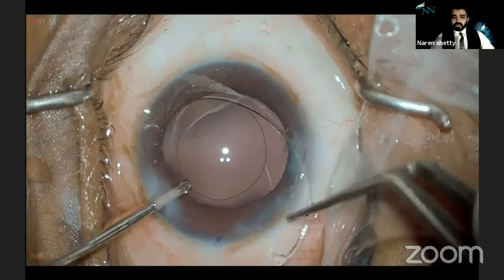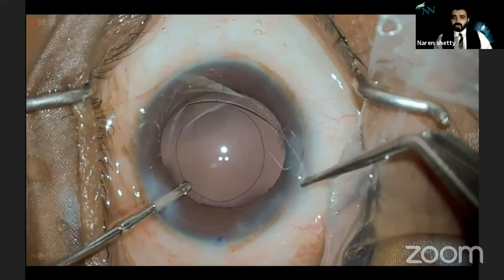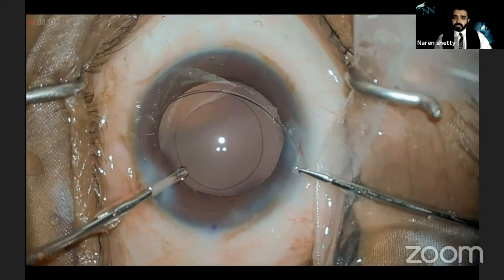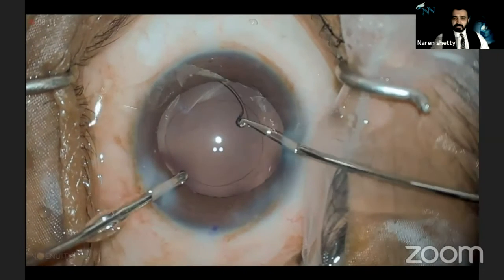All my toric patients, I always use a CTR. As you can see here, I implant it under irrigation. Once I've implanted the trailing part of the CTR, I hold it with a microforceps and place it into the bag. With this, I'm rest assured that by mistake the CTR doesn't slip into the sulcus.